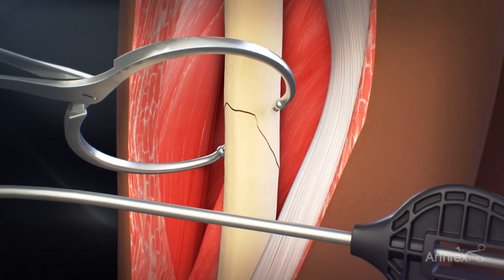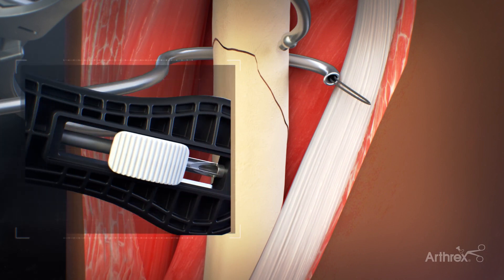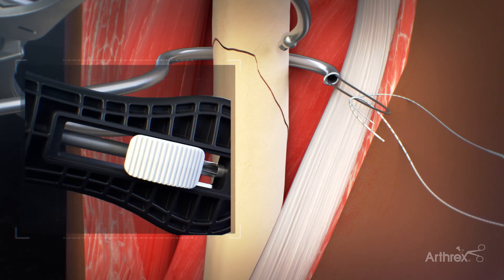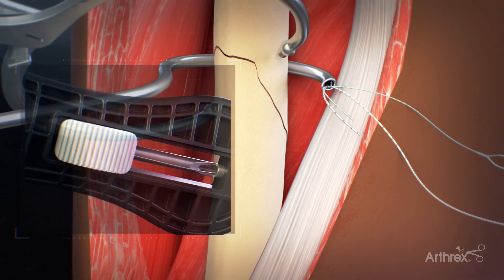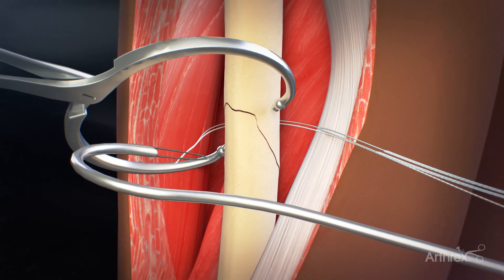Use a fiber tape cerclage passing hook to pass the cerclage suture and place the hook around the bone. Advance the passing hook's nitinol suture islet. Load the fiber tape cerclage suture tail into the islet of the passing hook along with the tail end of a TigerLink suture. Retract the nitinol islet and pull the hook back around the bone and unload the sutures from the islet.